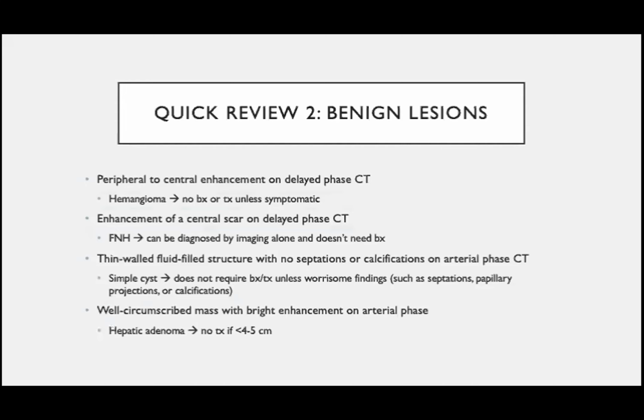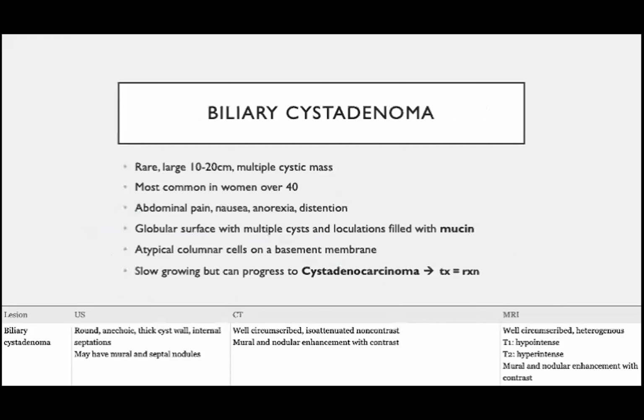Okay. So well-circumscribed mass with bright enhancement on arterial phase. Okay, why is it not? Sorry, it's not going to the next slide. Okay.